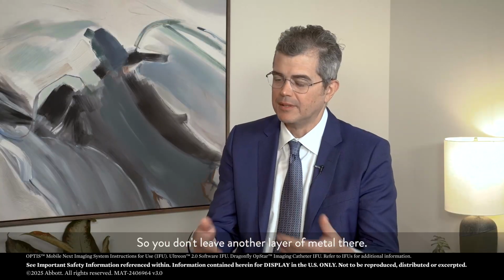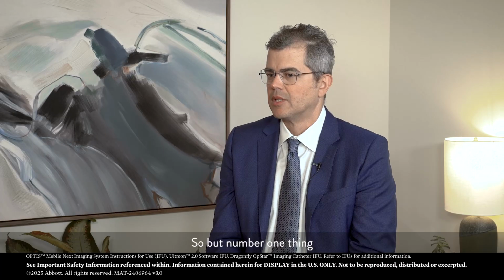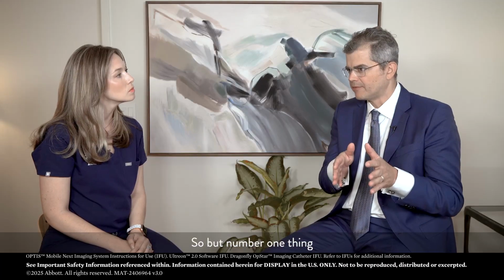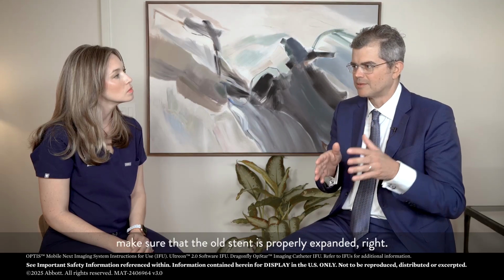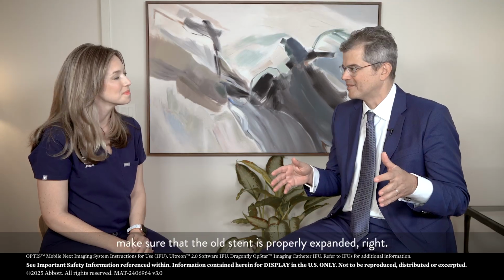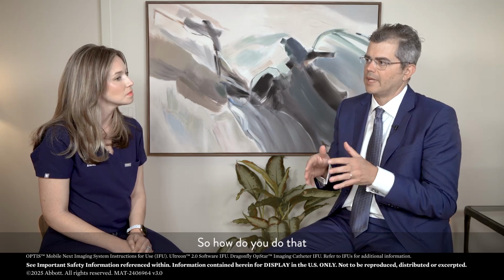So you don't leave another layer of metal there. But number one thing that you need to address is make sure that the old stent is properly expanded, right?